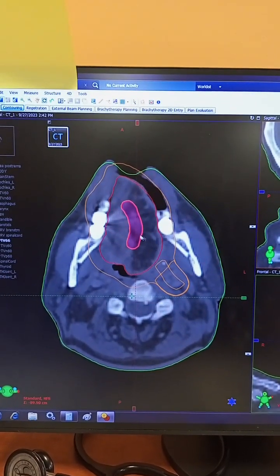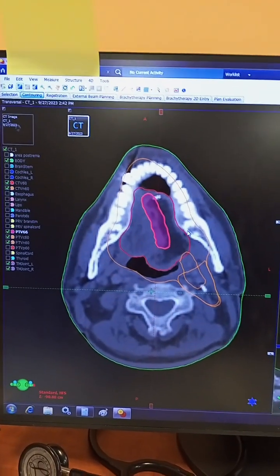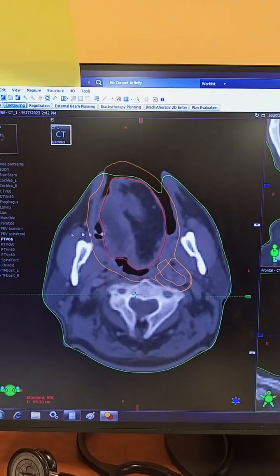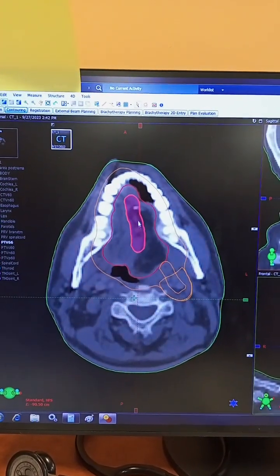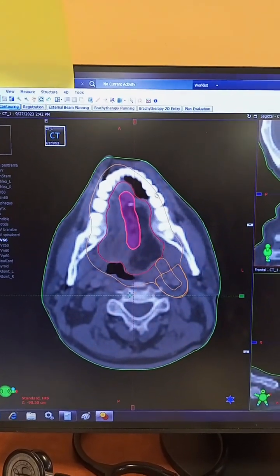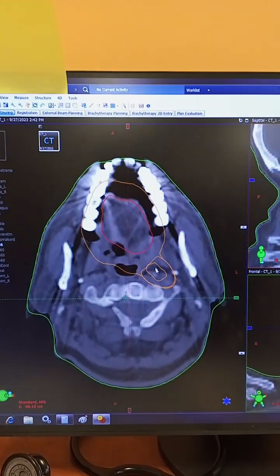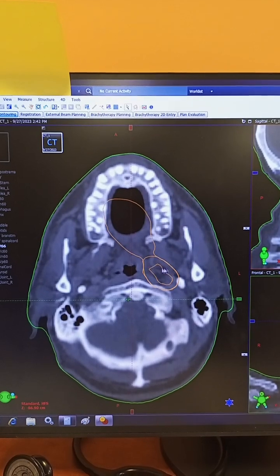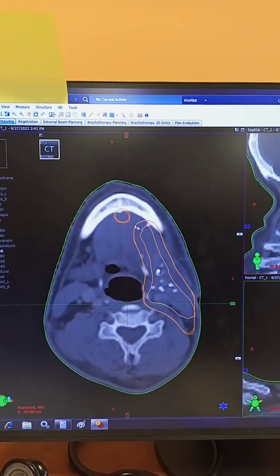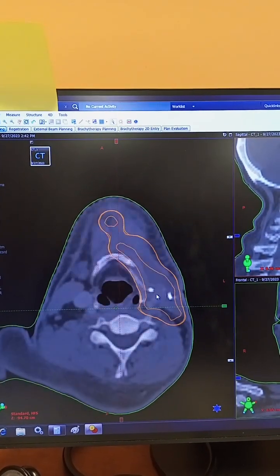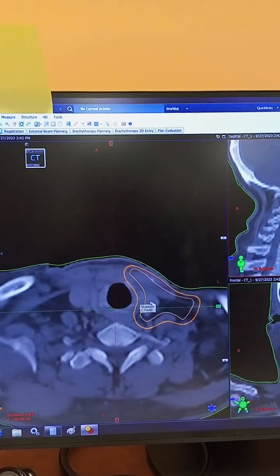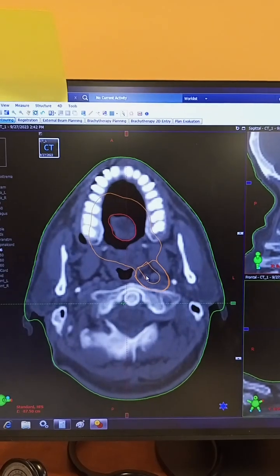Once these structures are drawn, we have also drawn the nodal structures. In the axial view we have the PTV 66 simultaneous integrated boost area, then the CTV 60 and its PTV, then the CTV nodal — which is the nodal area covering levels 1 to 4 of the left side. We have drawn the lymph nodes from level 1 to 4 of the left side along with their CTV nodal.